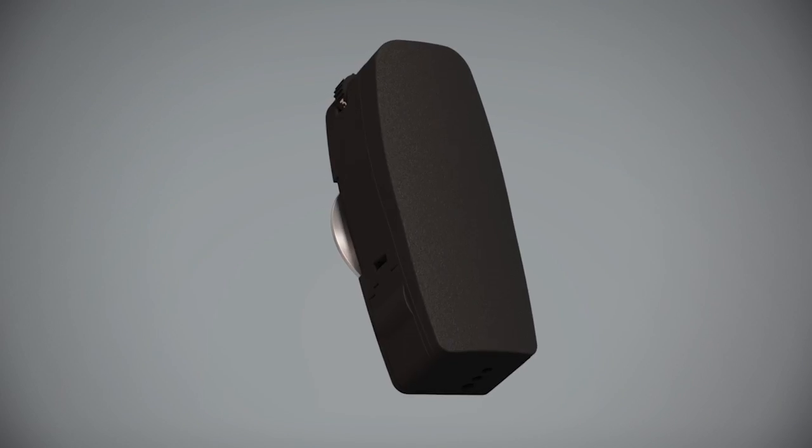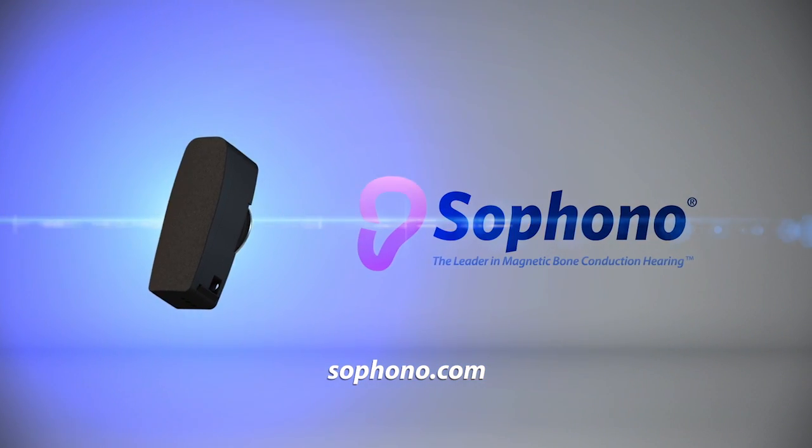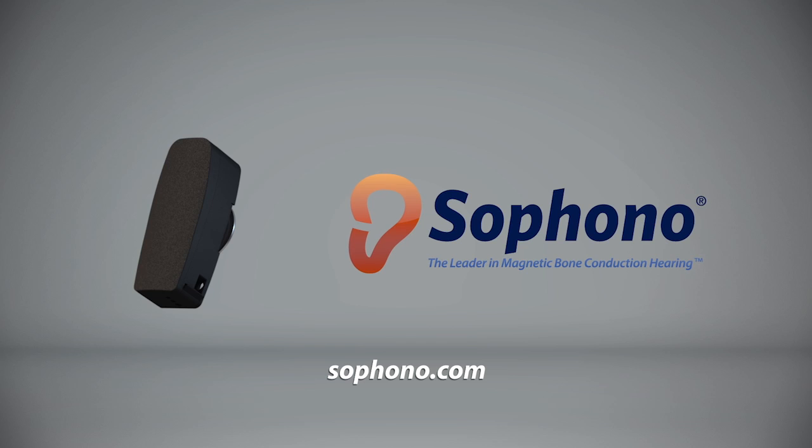The controls on the Sophono processor are simple and easy to operate. Please visit our website at sophono.com if you need more information.